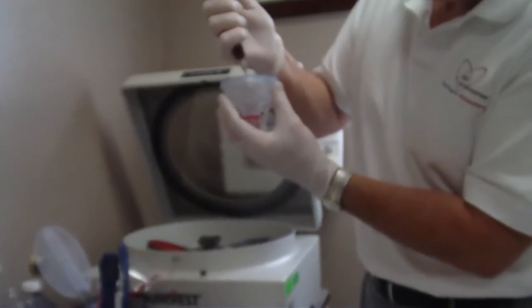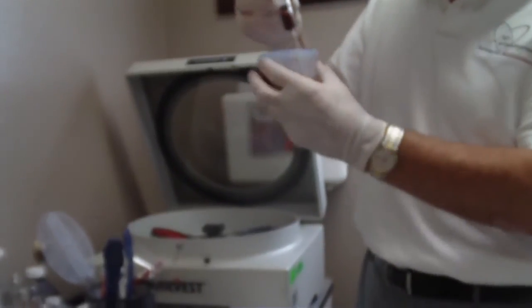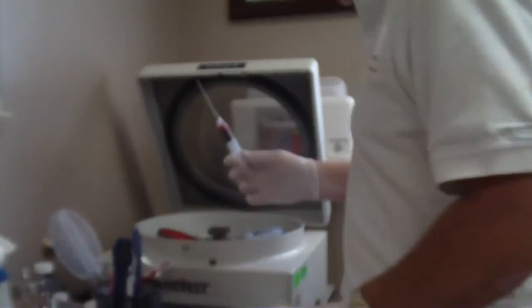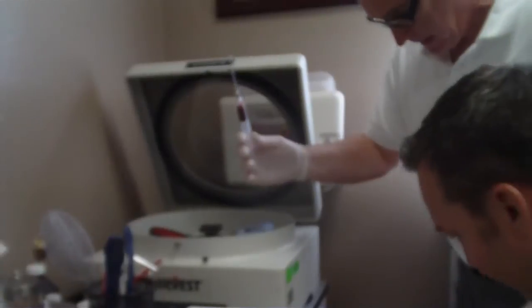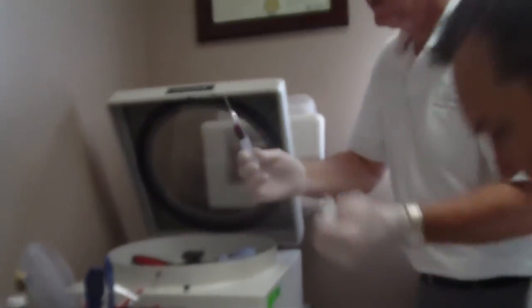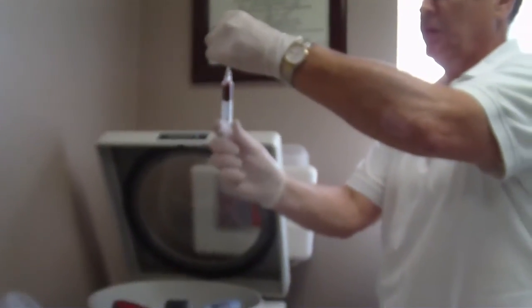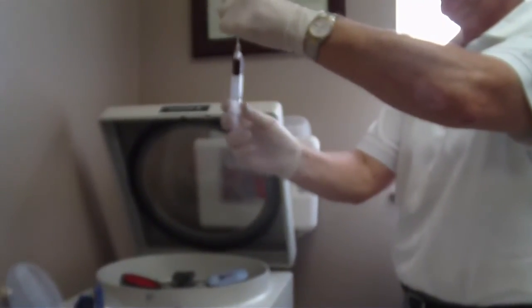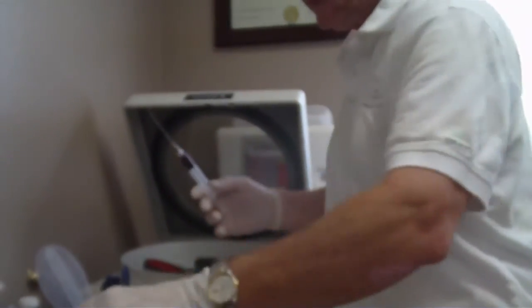So that's your concentrated platelets. If you had a normal platelet load of 100,000, this would concentrate it six times, so you'd have about 600,000. We end up with about three and a half cc's of an injectate from an original draw of eighteen cc's of whole blood.